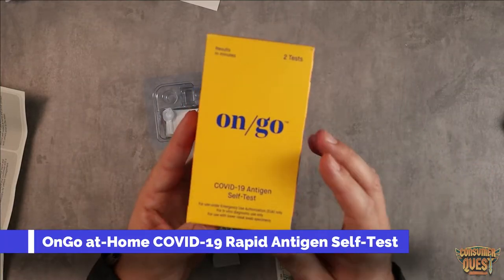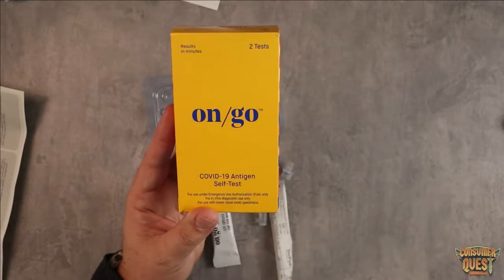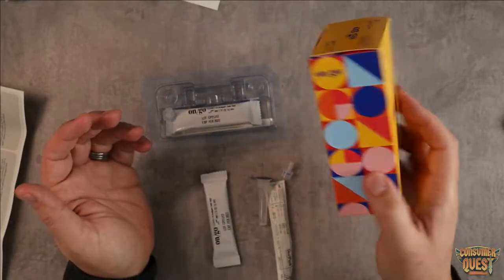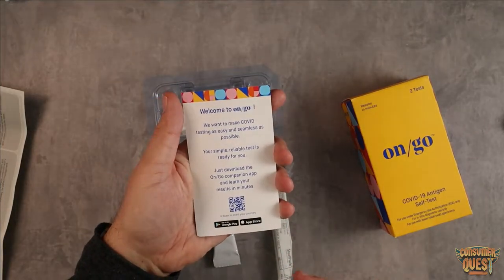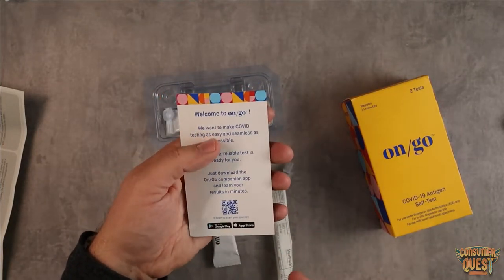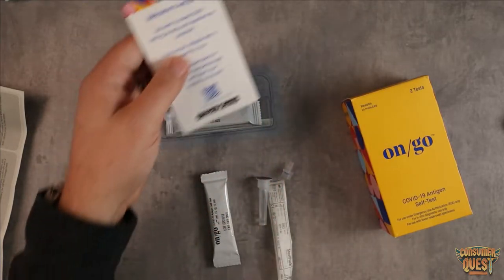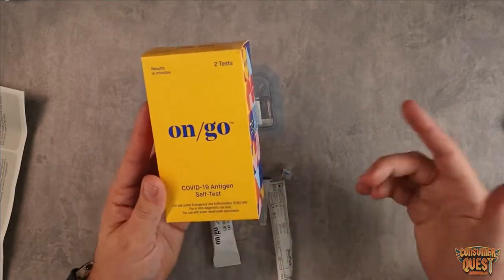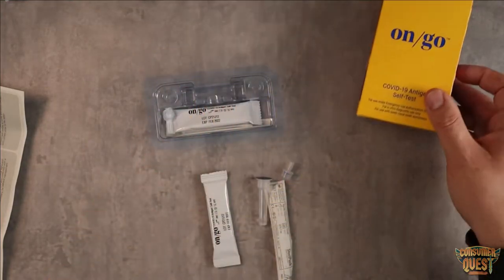Today I want to walk you through the on-go COVID-19 antigen self-test step-by-step. There is an app that you can download — it comes with a little app card. It's going to help you walk through the steps and read your results. But I'm just going to show you how to do it, because it's just as simple as some of the other ones out there on the market.